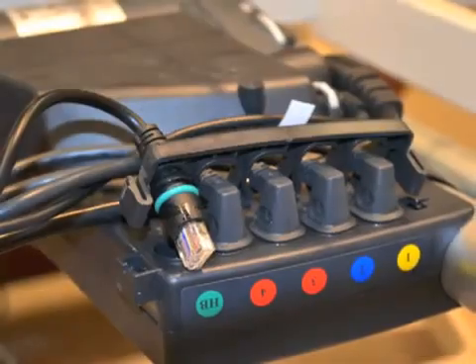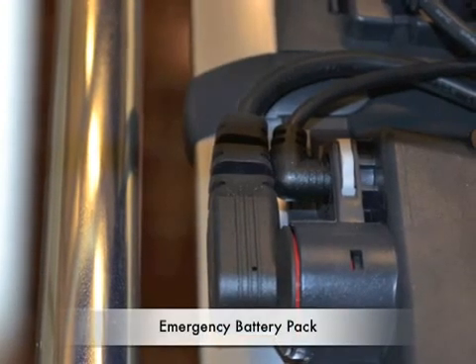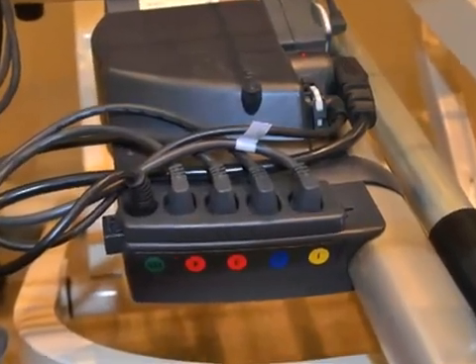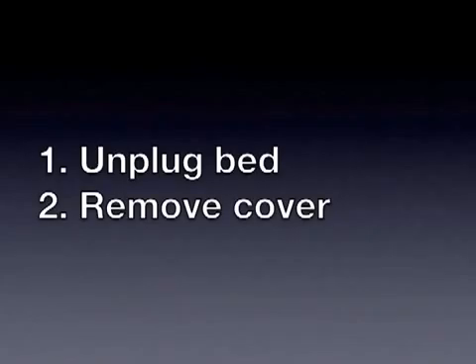The control harness is green, and additional plugs that go in the control box include the emergency battery pack and AC power. We will first test to see if the problem stems from one of the motors or if the problem is within the control box. Begin by unplugging the bed. Then remove the cover on the control box. And this can easily be done with a screwdriver.